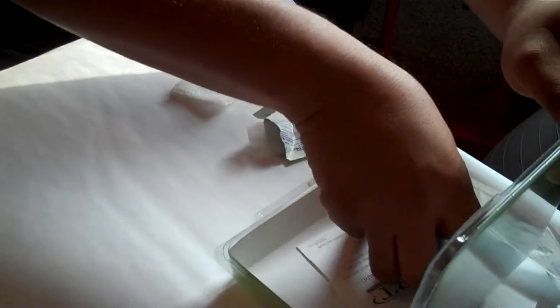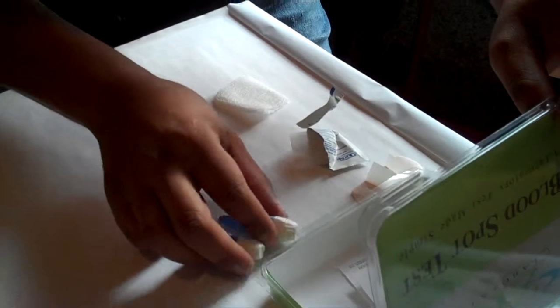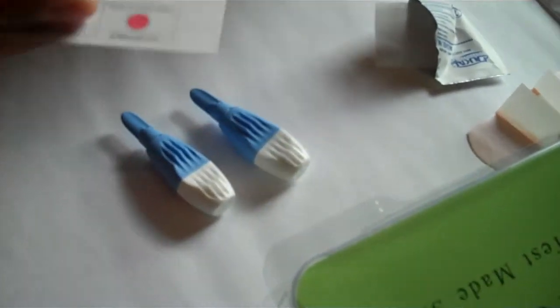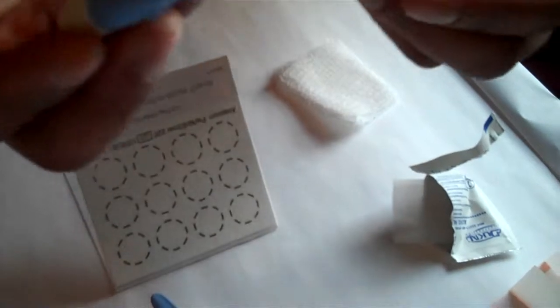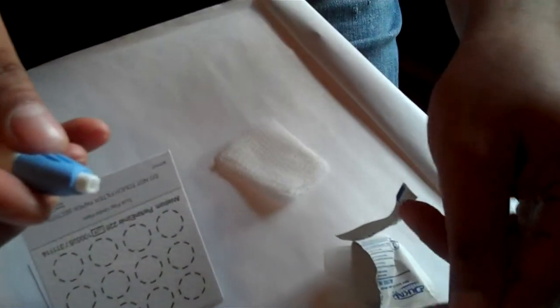There's your gauze — go ahead and open that up as well. Then you have two little lancets — that's what's actually going to poke your finger. Take your blood card and you don't want to touch the card itself, so try to avoid touching it. The lancet — you just twist off the top of the lancet.